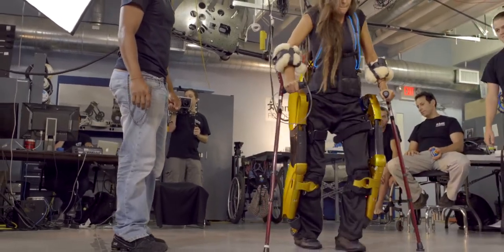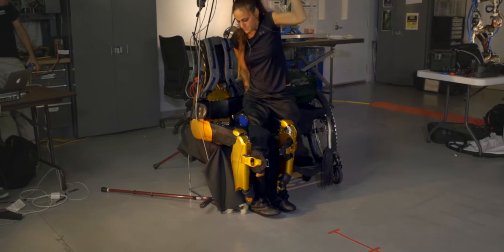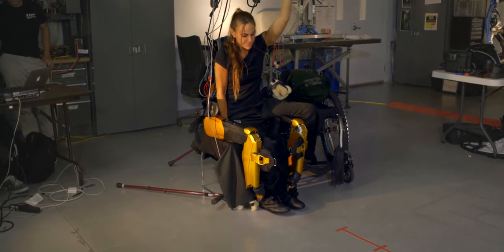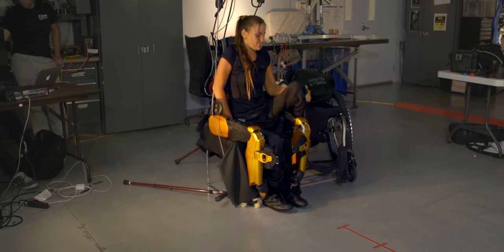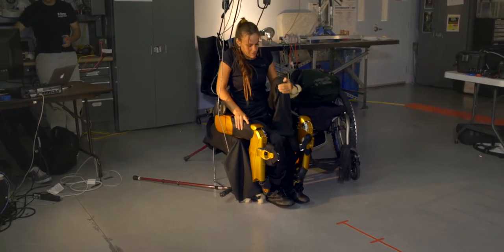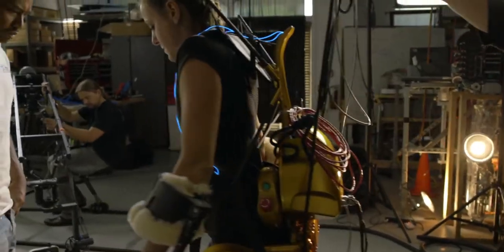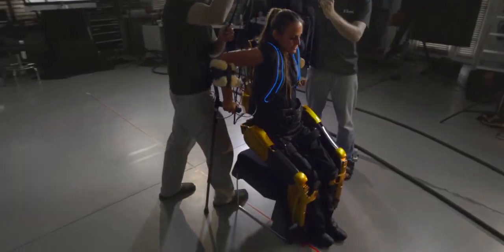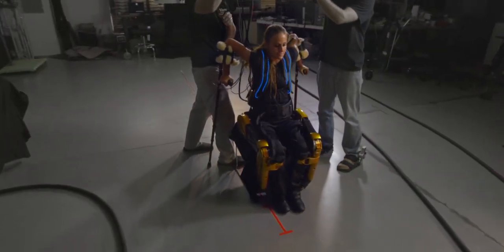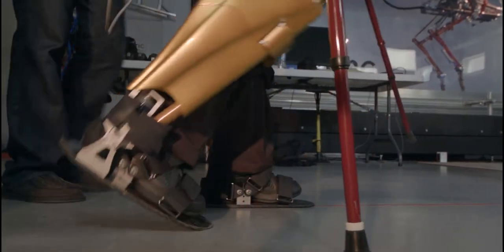The X1 also has some advantages. We designed special cuffs at the shin which enabled the user to transfer from a wheelchair into the X1 in a seated position — a self-transfer. We also tested sit-to-stand and stand-to-sit transfers from the exoskeleton. The X1 has more capabilities in terms of torque and speed.